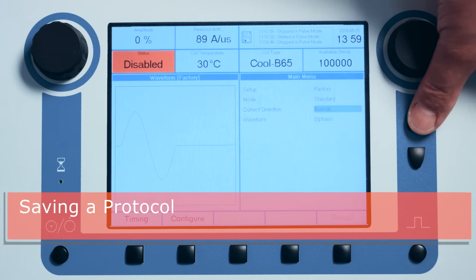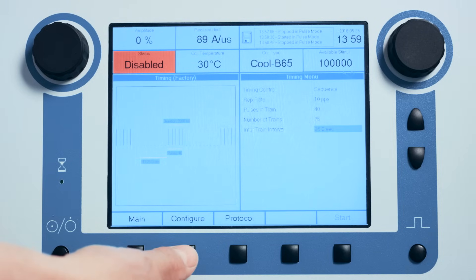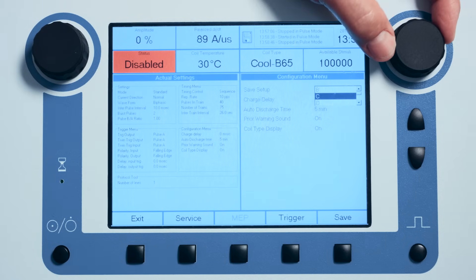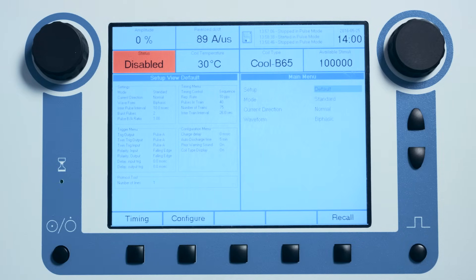To save a protocol, first define the mode, waveform, and current direction on the main page. Set the protocol parameters on the timing page, then navigate to the configure menu using the configure button. Navigate to the uppermost data field in the configure menu and use the pulse wheel to choose one of the predefined headers for the protocol, then depress the save button. The protocol is then saved under the chosen header and can be recalled from the main page by using the pulse wheel to select the protocol header from the saved setups in the setup data field. Recall the protocol by depressing the recall button, and the setup is loaded with protocol information populated in the protocol setup menu on the left side of the display.